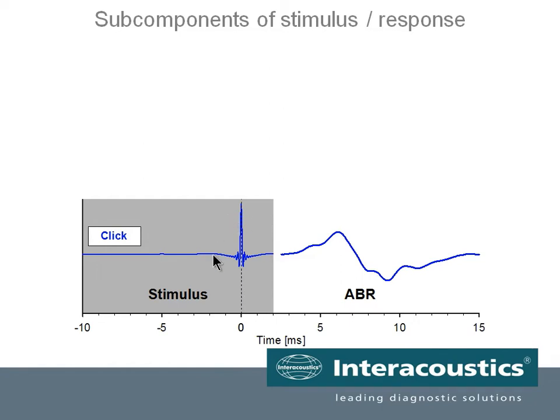If we then look at the click stimulus, it provides us this kind of ABR. We have a time scale down here with 0 milliseconds, so that is where our recording typically begins, and this is where we present our click in traditional systems. And we get our ABR response, which is here around, in this case, around 6 milliseconds for wave 5 peak, and a response is present.